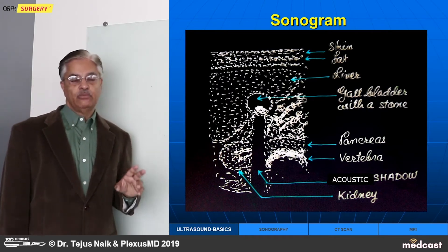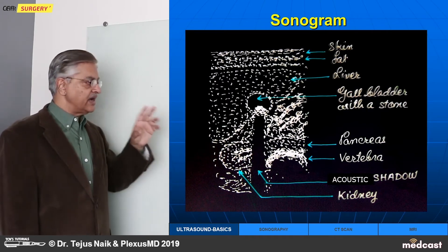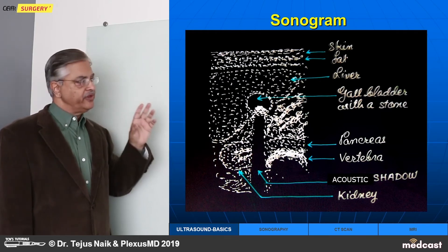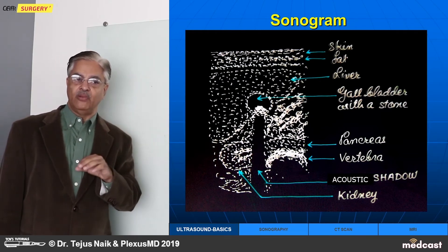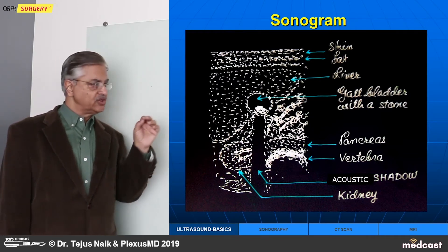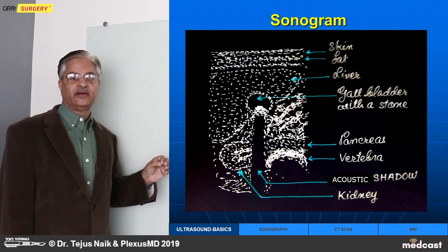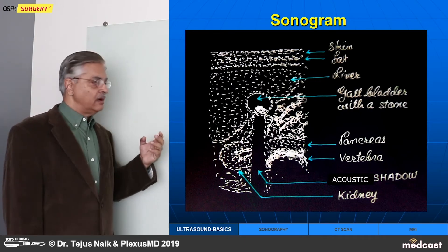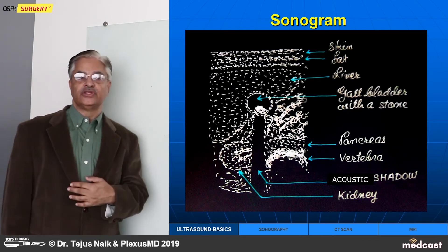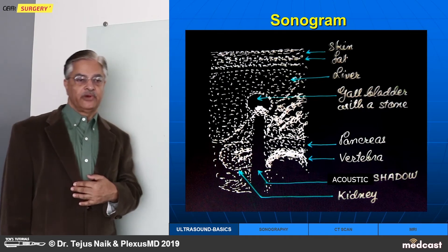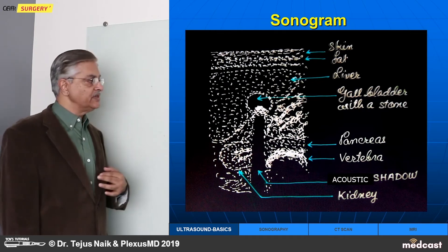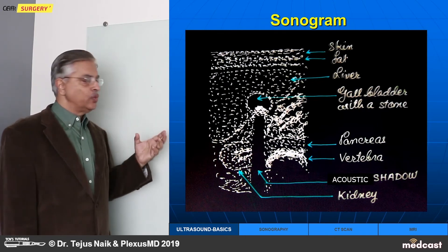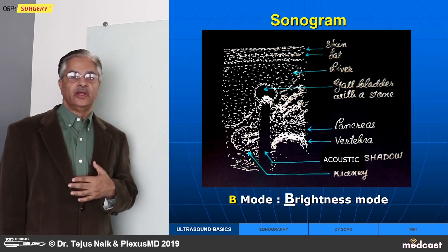So this is B-mode. I have tried to show the right hypochondrium with the abdominal wall, liver, and gallbladder. There is a stone in the gallbladder. Behind the gallbladder, we can see a kidney and the echoes from the vertebra. So this is B-mode — this is one picture of B-mode.